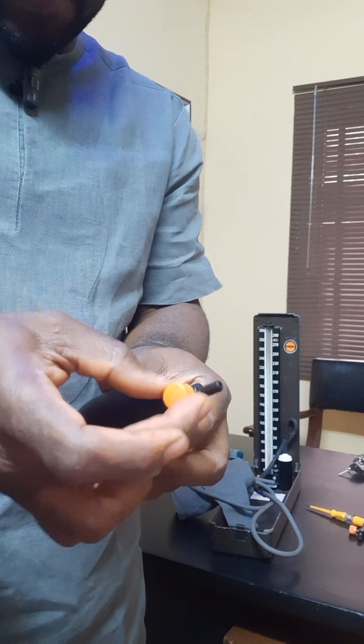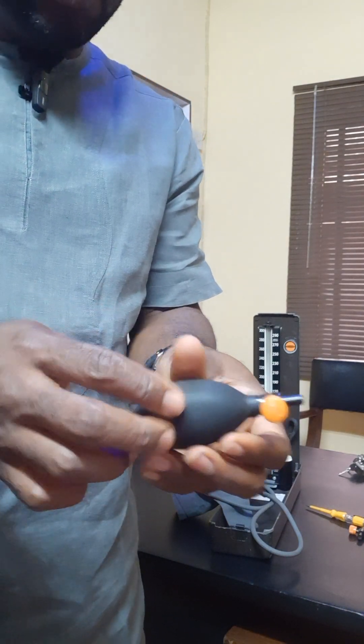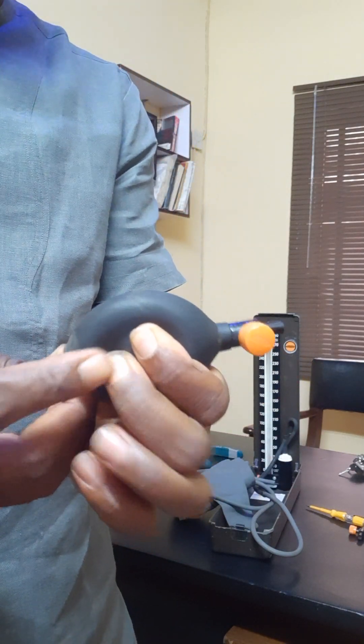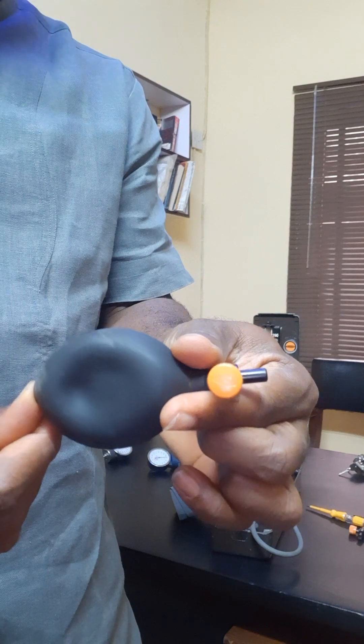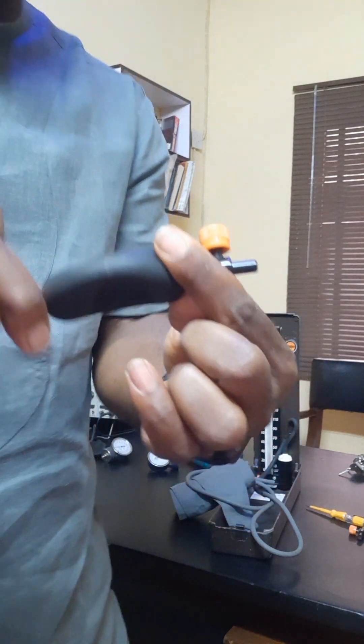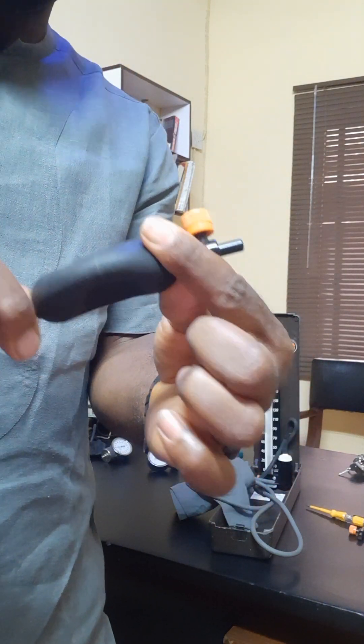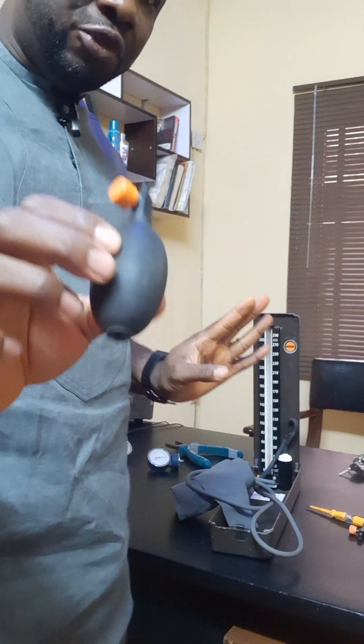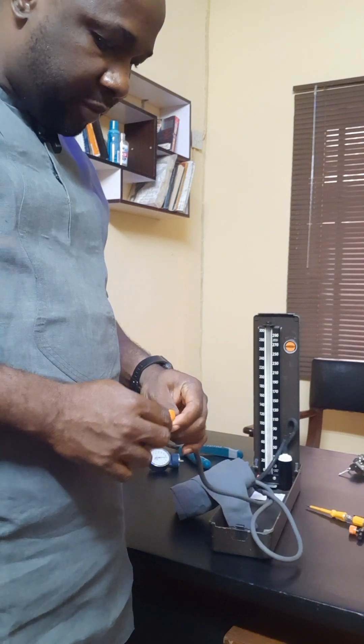Let me open it. It has to retain the compressed form. You can see. Then if I leave it, it will come back. So I am going to change with this one — change it with this very one.